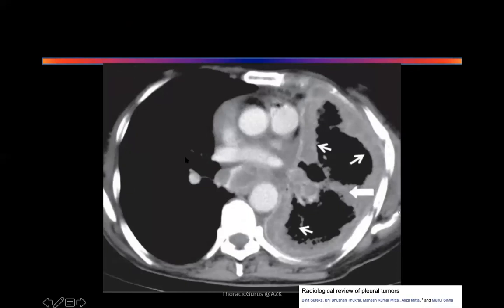Yes. Sir, it is a CT scan of the chest, contrast. Sir, we are looking into the mediastinal window. Here we are able to see the left parietal pleura is uniformly thickened and ragged, sir. And which is invading into, I mean, we are able to see it is showing the fissures involved. Yeah, the involvement of the fissures and extend. Pericardium. Yeah.